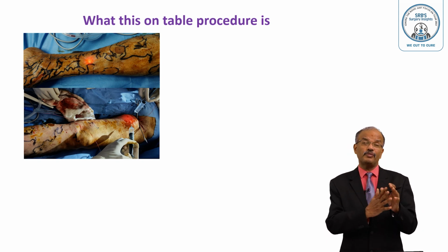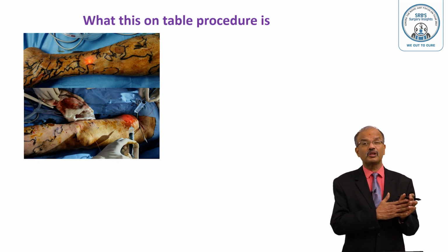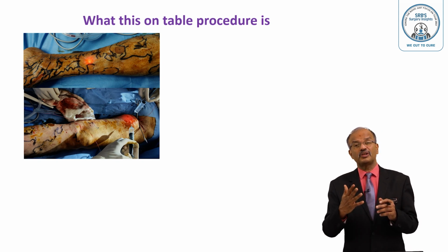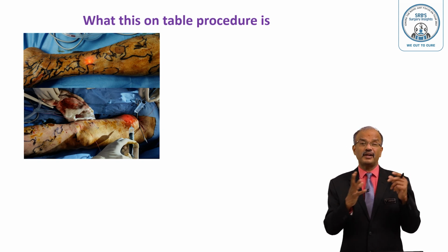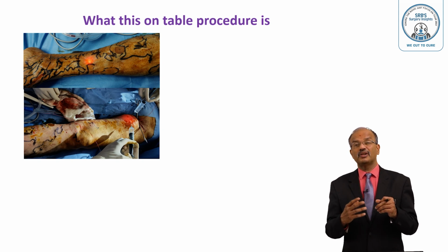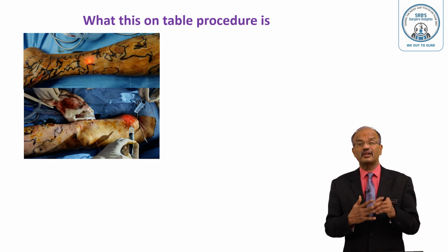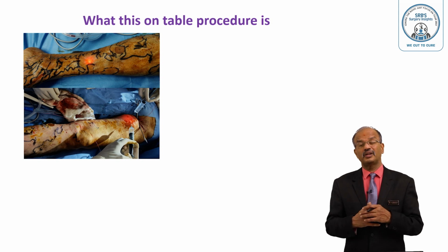Laser is the prime treatment. Additionally, we may add foam sclerotherapy, microfoam therapy, using sodium tetradecyl sulfate. It's a very cheap drug. You take 5 ml air and 0.5 or 1 ml of the drug, create a foam, and inject it into the specific vein after cannulation. It also causes clear sclerosis, and it's a very good method to treat all these things. So that is the basic.